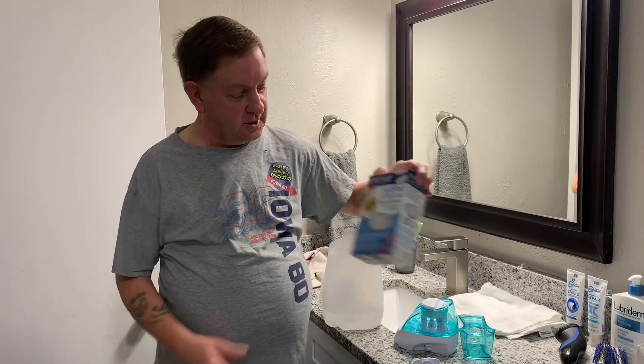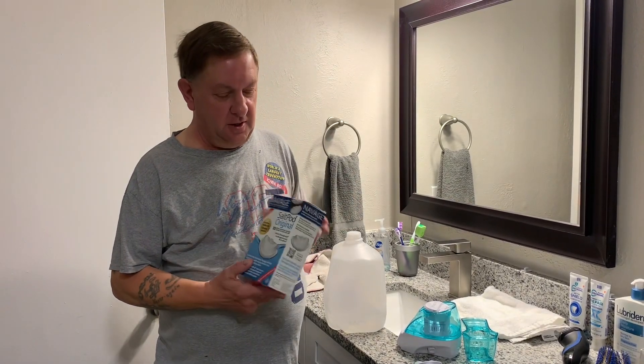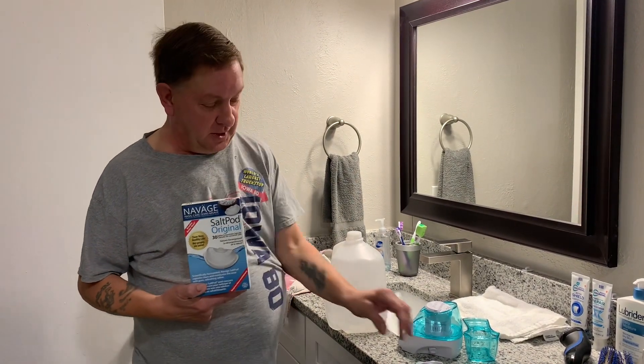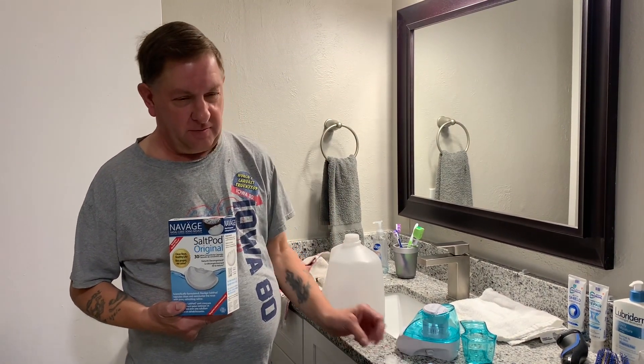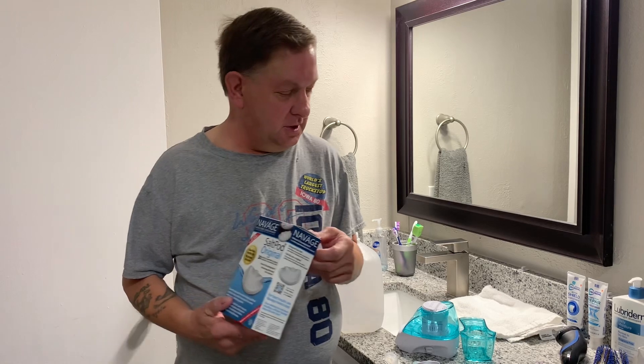I got this at Walmart the other day. You can get 30 of these salt pots for about $10 or $11. Just to let y'all know, you don't have to order it from the company — you can also buy them at Walgreens and CVS.